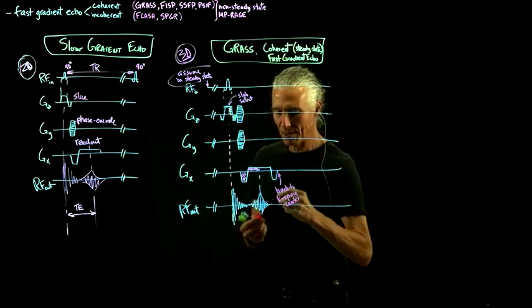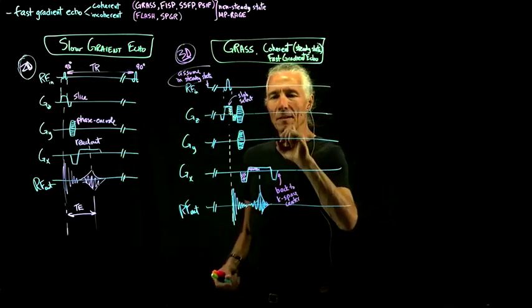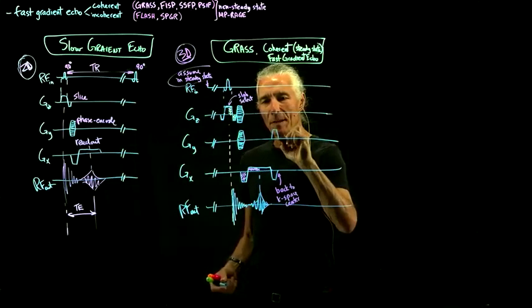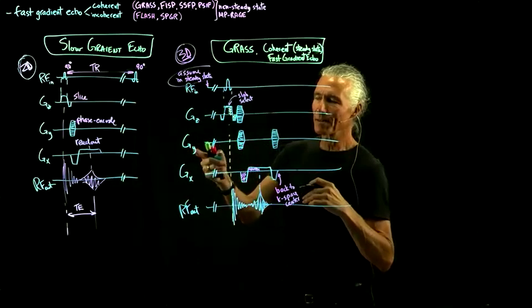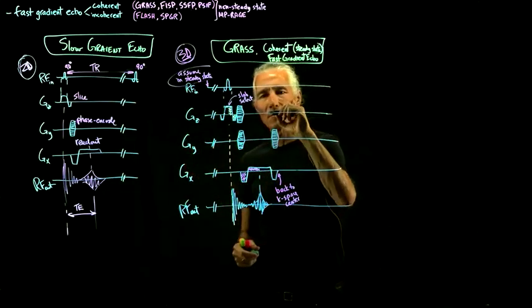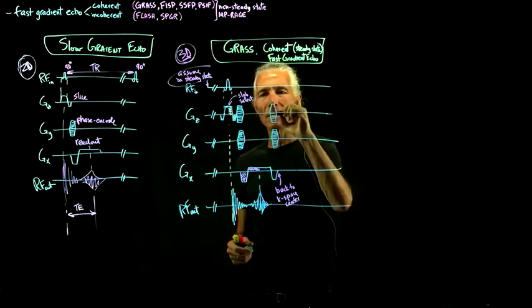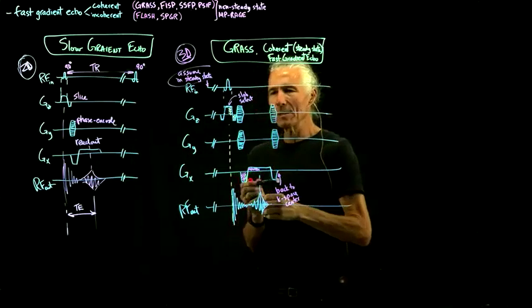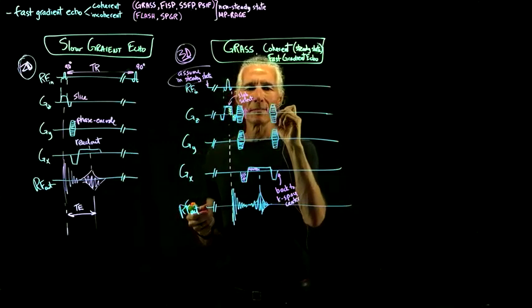And then we just do the same thing with the other gradients. I just patch everything back up again with the other gradients, because this one will put us off from the k-space center in the y direction, and this one would have put us off from the k-space center in the z direction. So if we went that direction, then we have to go back that direction.